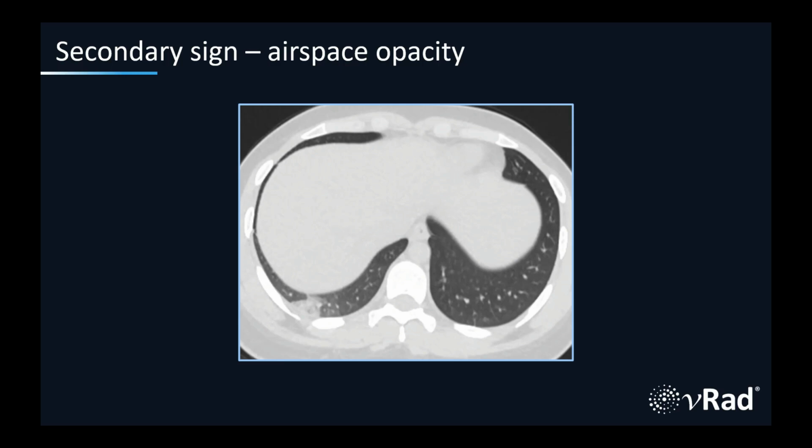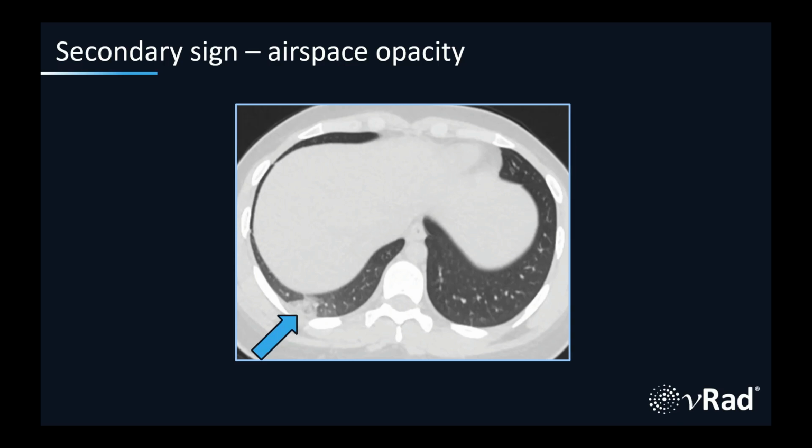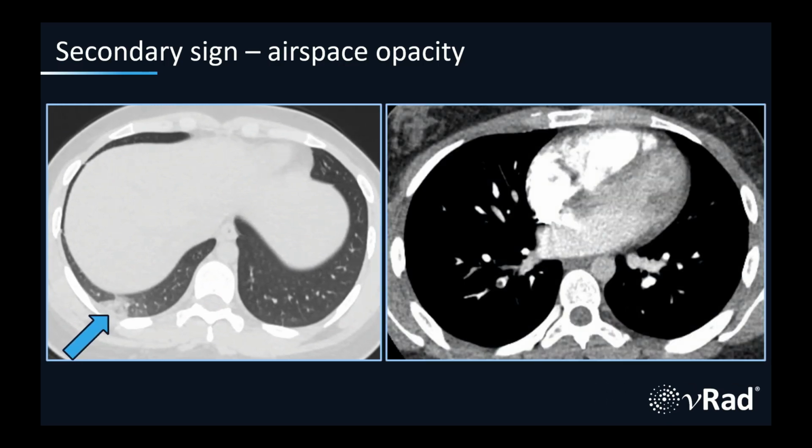Here's another case that was submitted as a great call. This is a 22-year-old female abdomen pelvis CT non-contrast stone study done for the indication of right flank pain. The radiologist recognized this peripheral airspace opacity within the right lower lobe, and their impression said this: a small region of consolidation in the right lower lobe. This finding is nonspecific but could be secondary to pneumonia, pulmonary parenchymal infarct, or contusion. In contacting the clinician to get additional history, it turns out there was no history of trauma. There were no signs or symptoms of infection, and so pulmonary parenchymal infarct was leading in the differential diagnosis in the patient who had just started oral contraceptives.